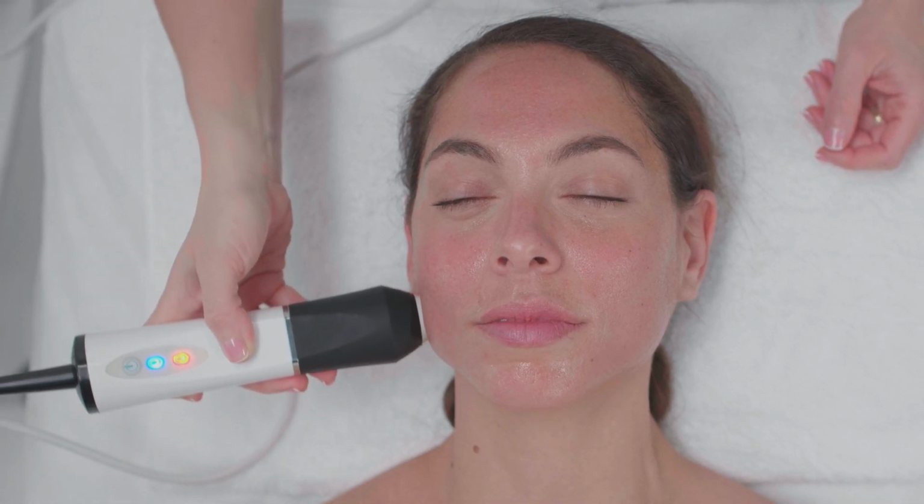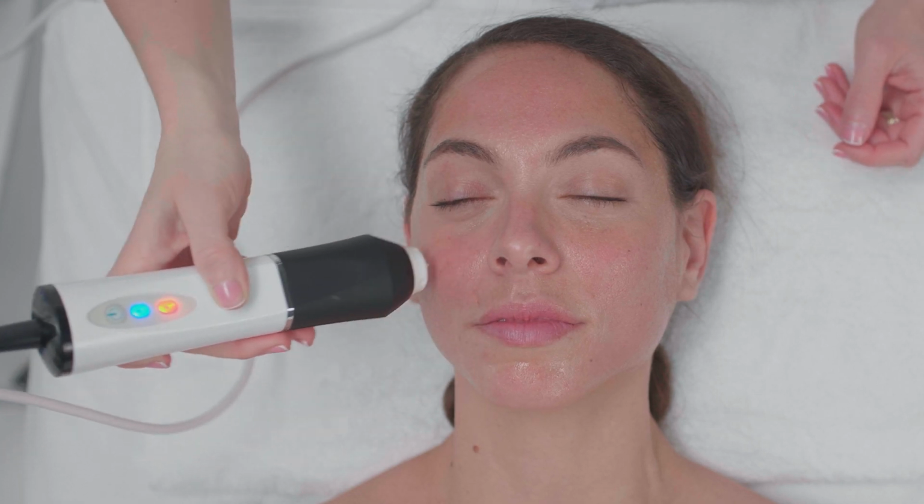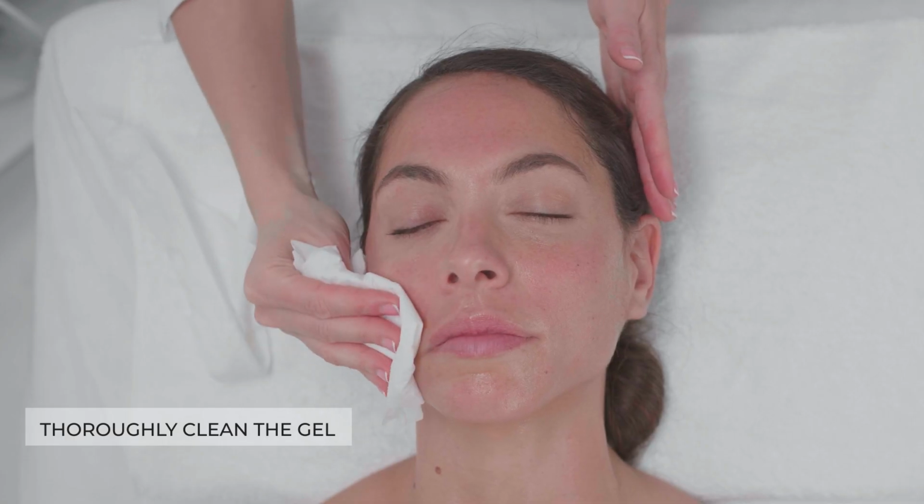A beep will sound 1 minute before the end of the session, and again at the end of the session. Thoroughly clean the gel off the face and proceed to the next session.